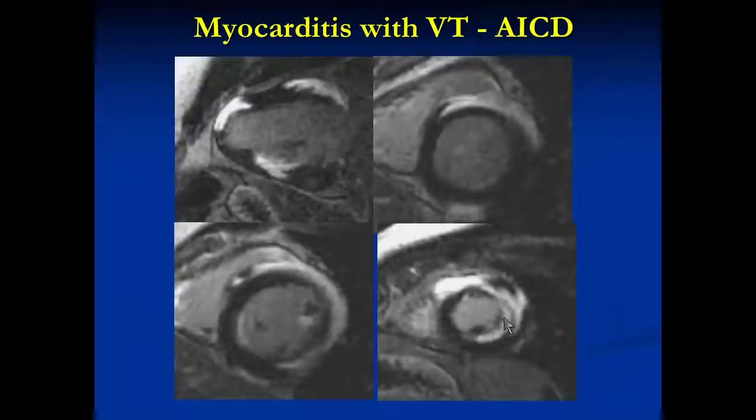Sometimes they will present with arrhythmias, with VT outside, and be brought to the hospital. They may have a troponin that is a little bit elevated, but will have gadolinium enhancement that is generally subepicardial like this. So this is a typical presentation of myocarditis.